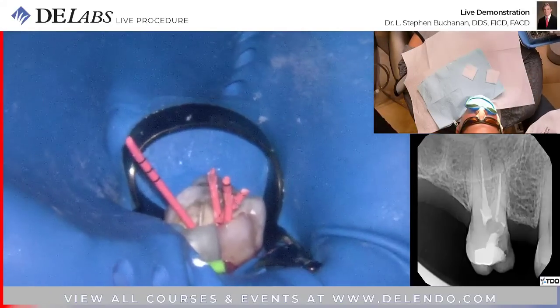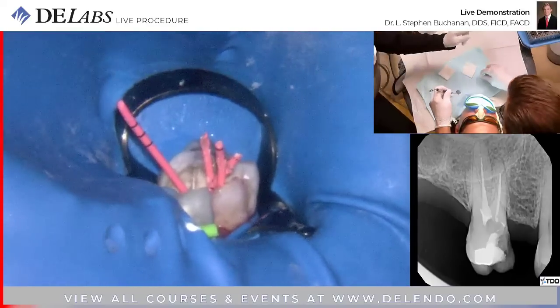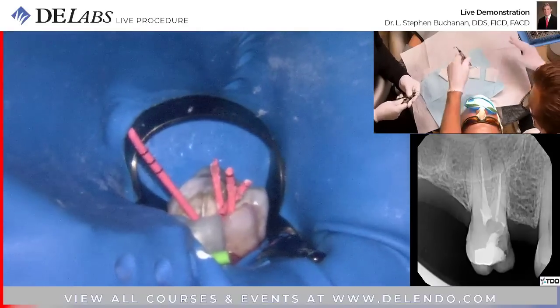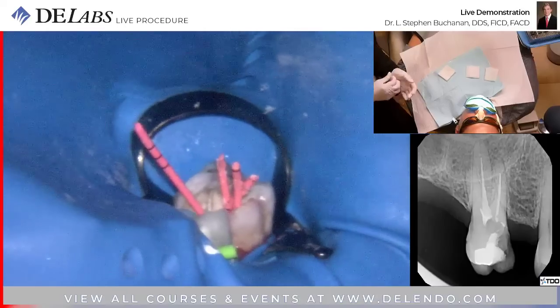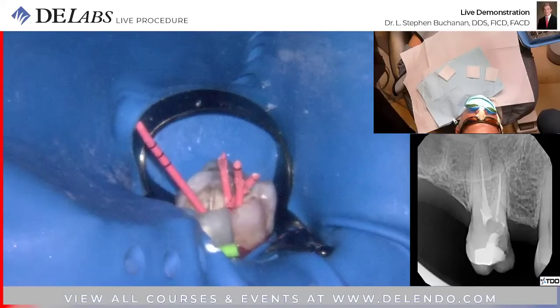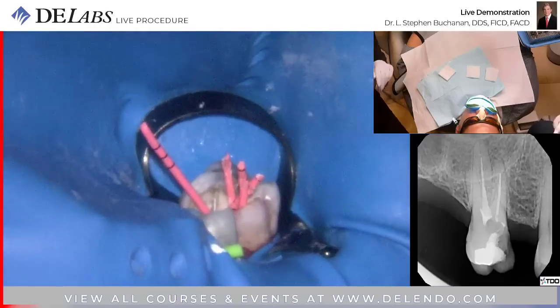Nice. Okay, first time using new continuous wave pluggers. I'm psyched. Oh, sorry. Yeah, they're exactly like the ones I've used for the last 25 years. Trust me, it's not doing anything new here. All right, I can understand the nervous laugh. Shut up.